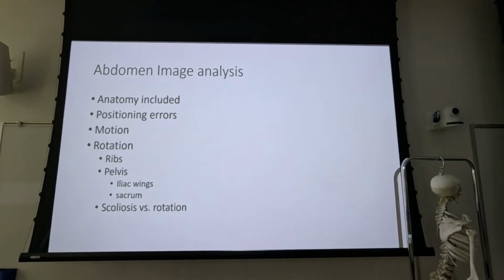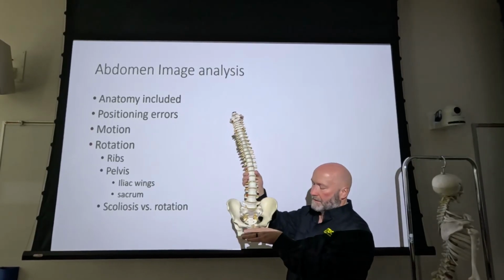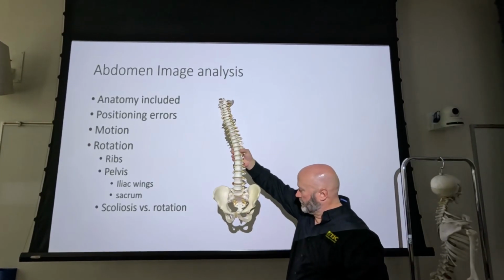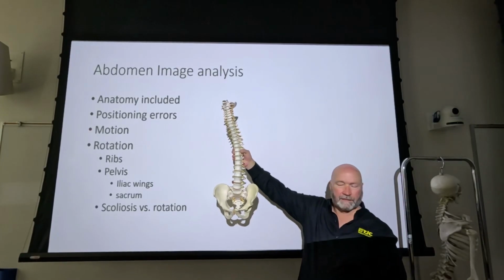So your pelvic wings are at an angle with the patient laying flat on their back. And if they're straight, they should be symmetric. But if they have any degree of rotation, they're not going to be. All right? So you want to see as high up in the abdomen as possible down to at least the symphysis pubis. So no rotation, right? But as we have rotation, look at what happens to the appearance.